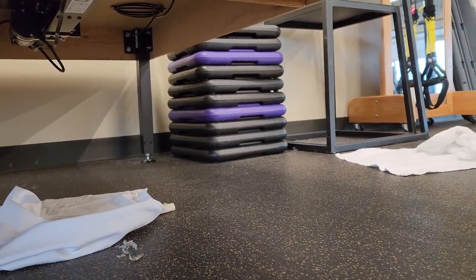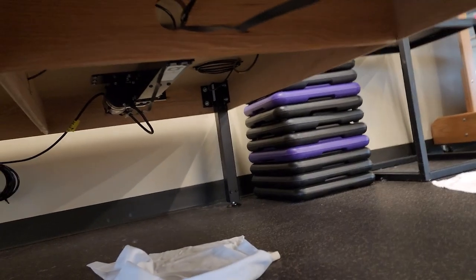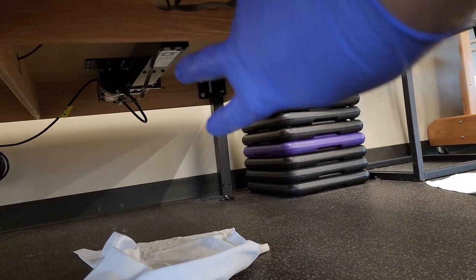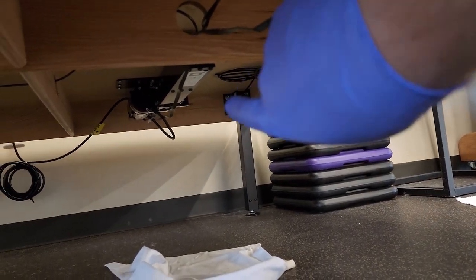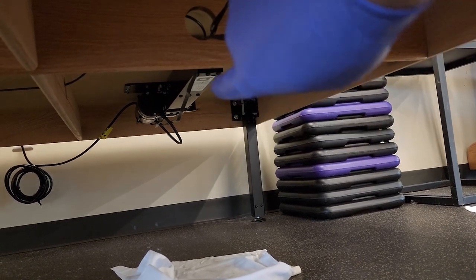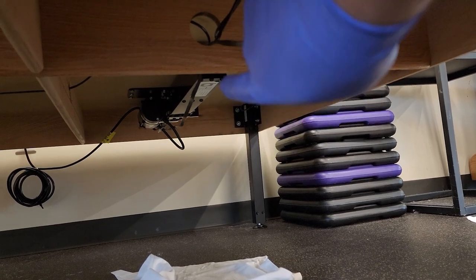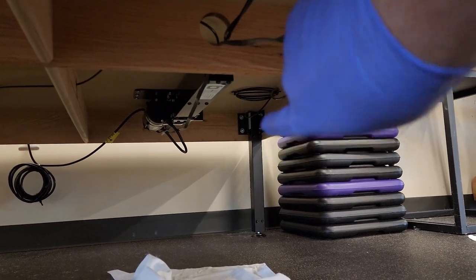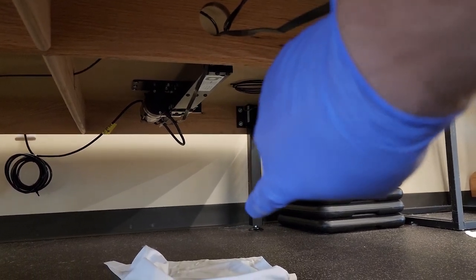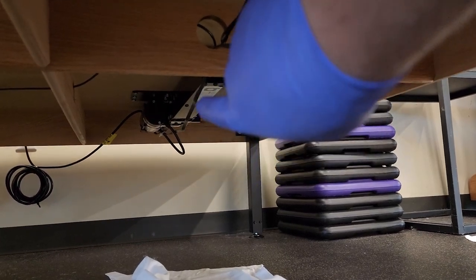It's going up over there, isn't it? What about this one? It's not moving. Okay. So, since I switched those two ports, that means one port is clogged for whatever reason. There's probably a little reed valve and/or solenoid, because it has to activate the solenoid one direction or the other. So something is not right on that one channel, and it moved the problem from this leg to this leg over here. So the problem is indeed inside the cylinder.